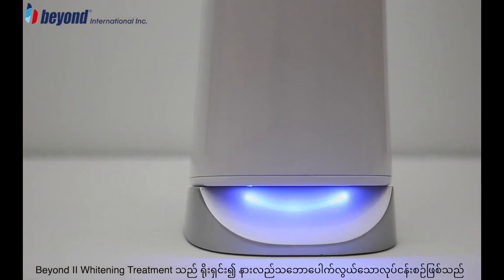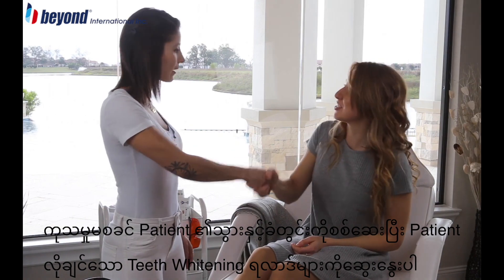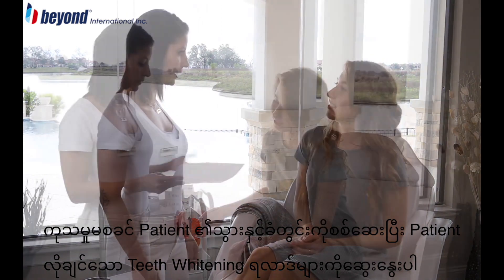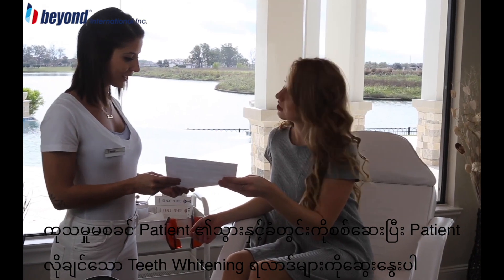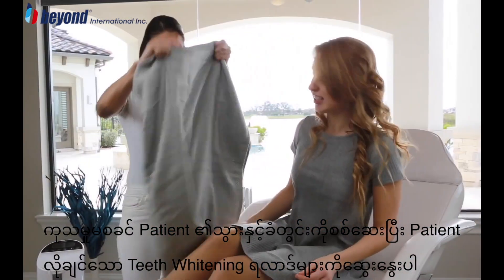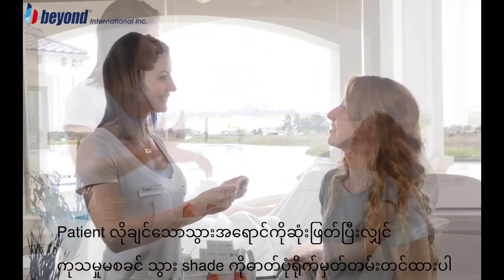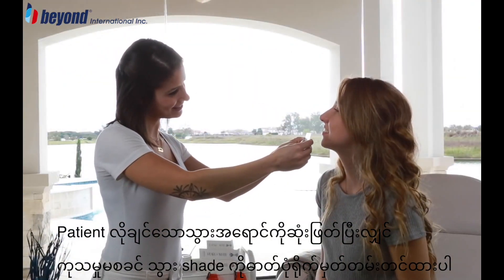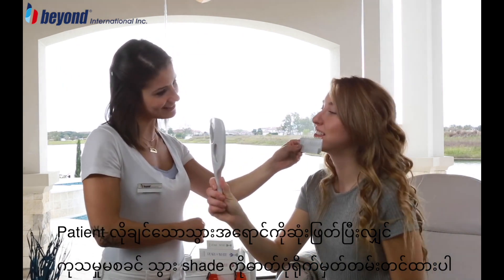The Beyond 2 Whitening Treatment is a straightforward and simple procedure. Before beginning treatment, perform a pre-treatment oral exam and consult with the client on their desired whitening results to determine the best treatment plan for their individual situation. Determine the pre-treatment color of the client's teeth and take a photo to document the shade before starting treatment.